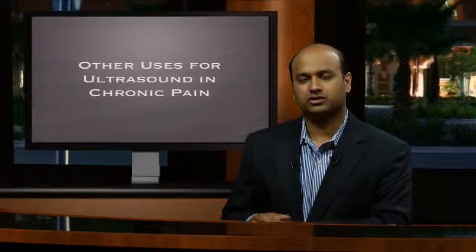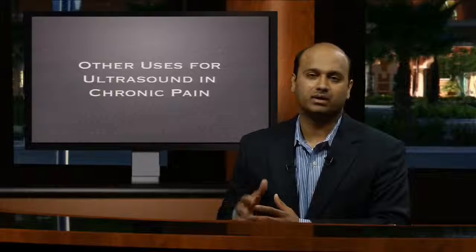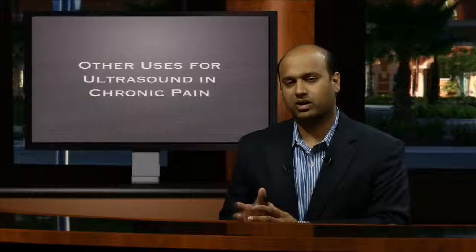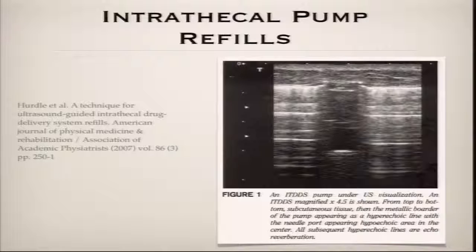So ultrasound can be used in a variety of these conditions, limiting the radiation and making it more accessible to more patients because we don't require high-tech equipment, we don't require the same amount of space that fluoroscopy and CT require. One other example I want to give you before closing is intrathecal pump refills. Obviously, we're injecting high concentration medications into these intrathecal pumps, and we want to make sure that we inject that properly. Using the ultrasound, you can identify the injection diaphragm and make sure that the needle enters the diaphragm at the appropriate level so that you can provide only one stick and have success with that one stick when you're refilling your intrathecal pumps.